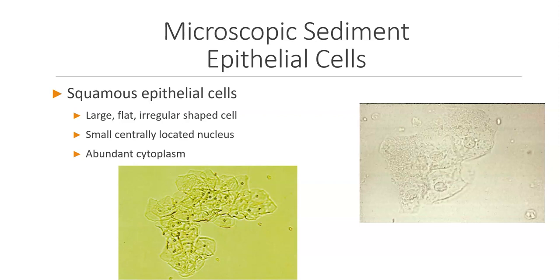These cells are large and flat, about 30 to 50 microns in diameter, with a single distinct nucleus about the size of a lymphocyte or a red blood cell. The cell may be rectangular or round, and the edges may be curled.